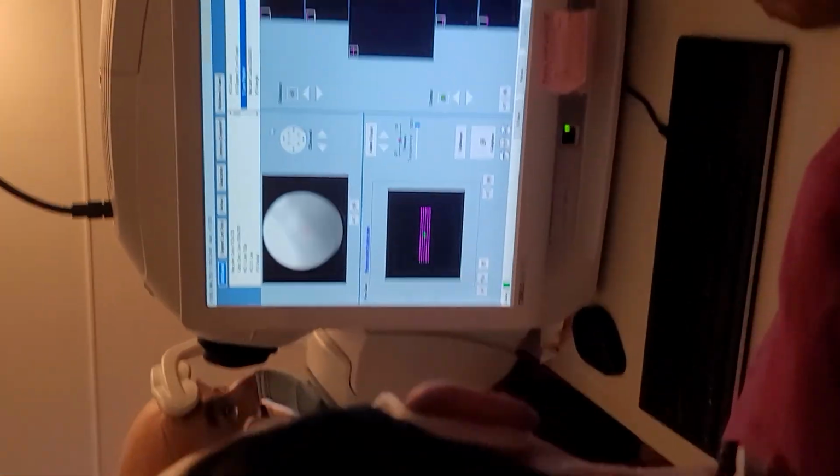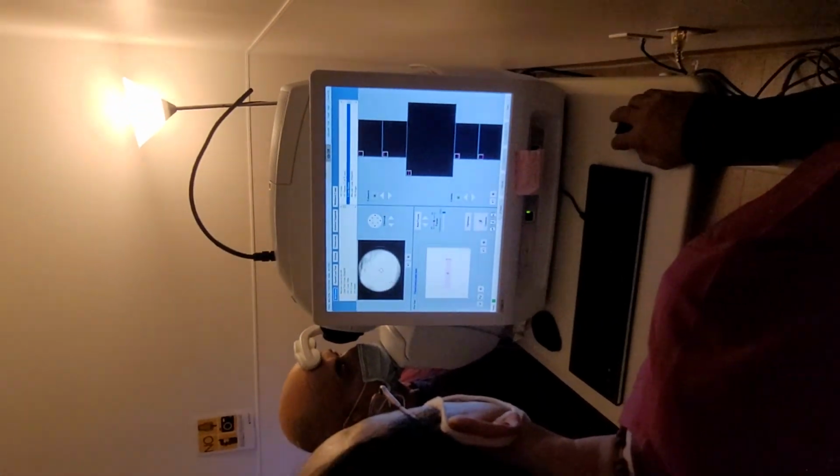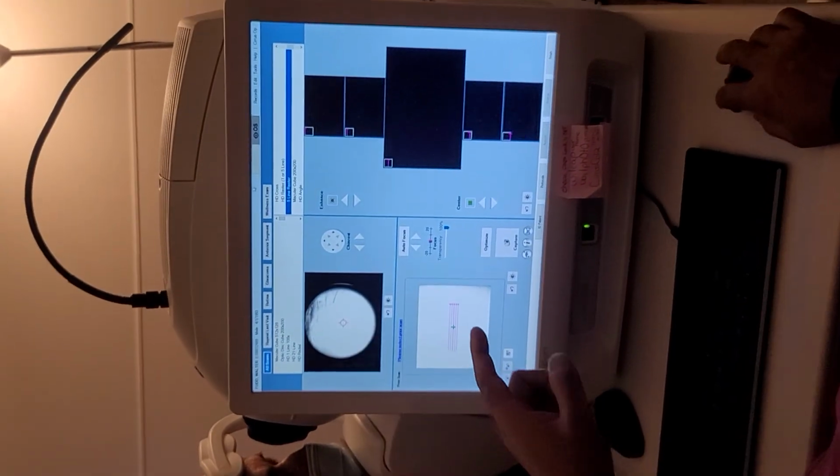Okay, so now we're gonna do the 5 line, right? Okay, and we're gonna do it on his left side. Okay, make sure you have the 5 line chosen, and you do, right? Yes, I already clicked it.